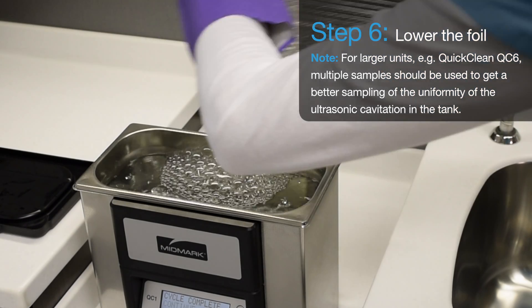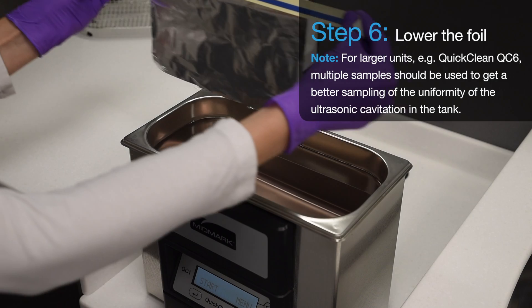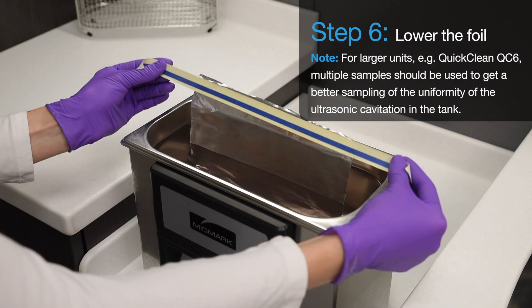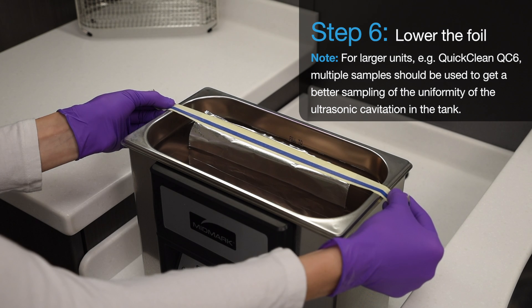Step 6. With the ultrasonic cleaner off and the basket removed, lower the foil sample into the center of the tank, positioning it so the foil isn't touching the sides or bottom of the tank. Note: for larger units, for example the QuickClean QC6, multiple samples should be used to get a better sampling of the uniformity of the ultrasonic cavitation of the tank.